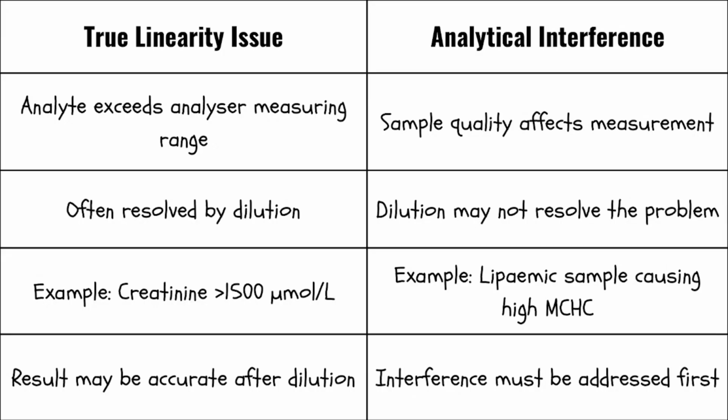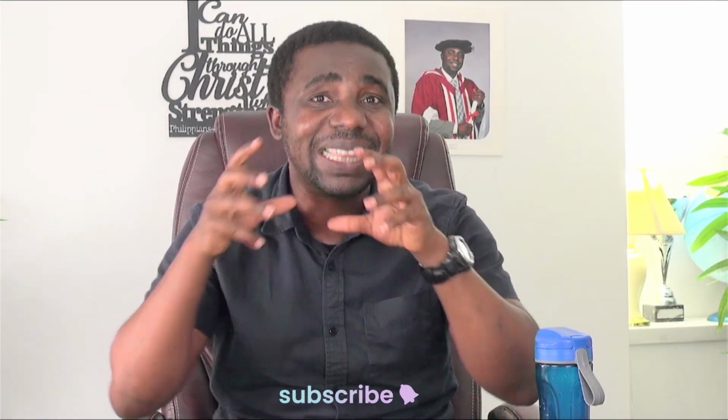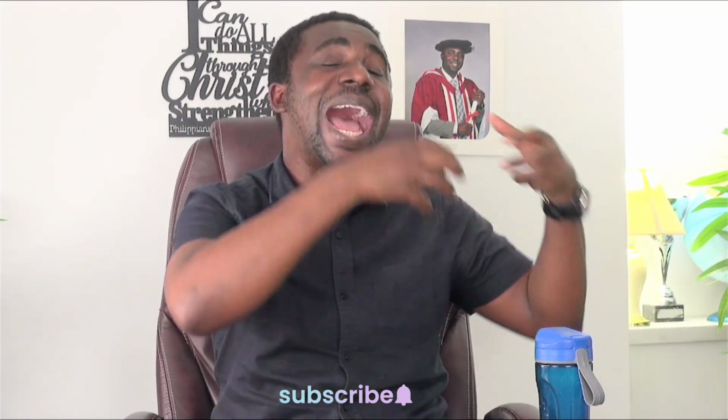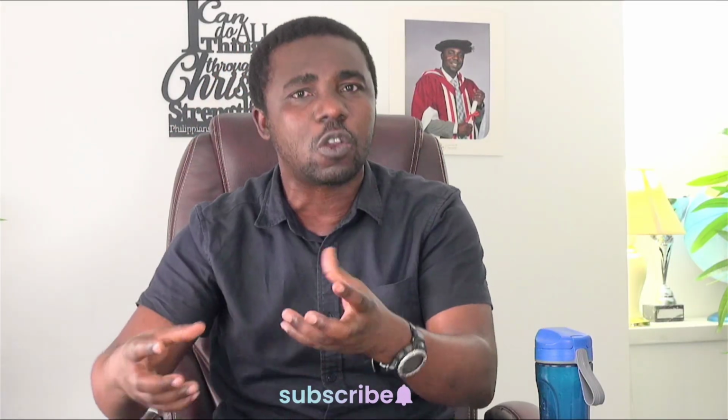Okay? All right. So when it comes to a true linearity issue, the result may be accurate after dilution. If it is genuinely due to a high concentration of the analyte, you can get a reliable result after dilution. However, if it is not genuinely high, interference must be addressed first. So the bottom line of what I want to say is this. If you notice that your sample has failed the HIL test, hemolysis, lipemia, and icterus, and it failed linearity, your challenge at that time is no longer linearity, it is the sample, okay? And the quality of the sample is what you need to focus on, not the linearity.